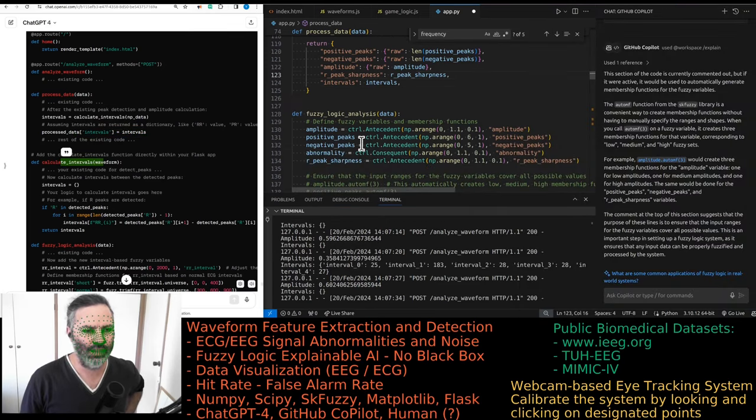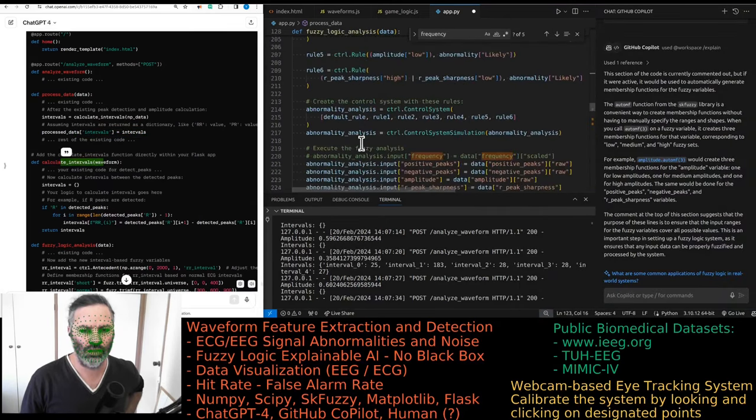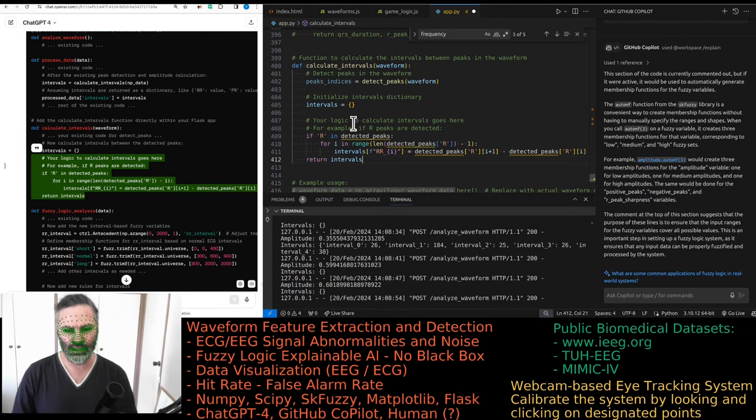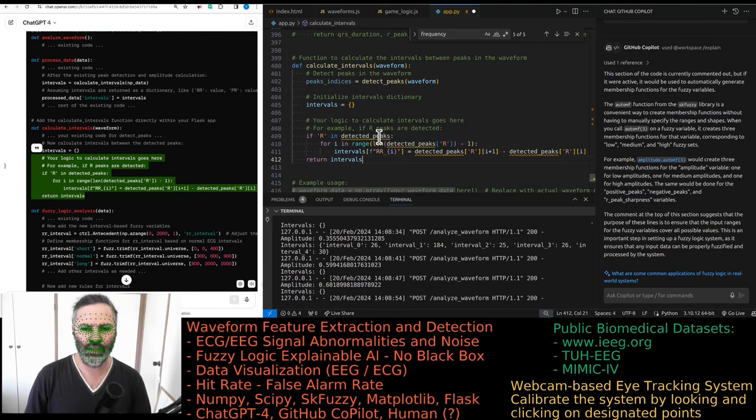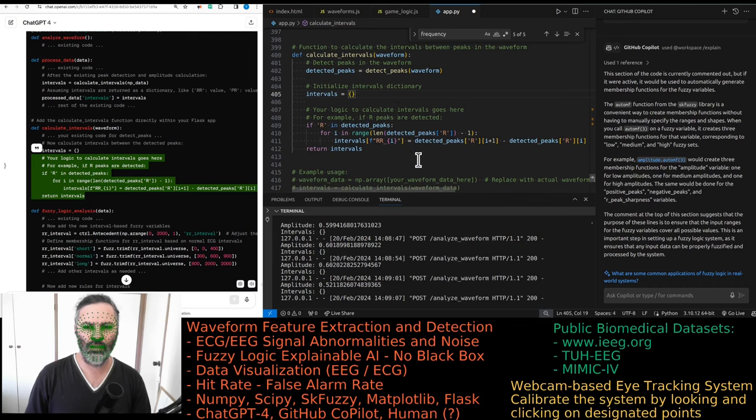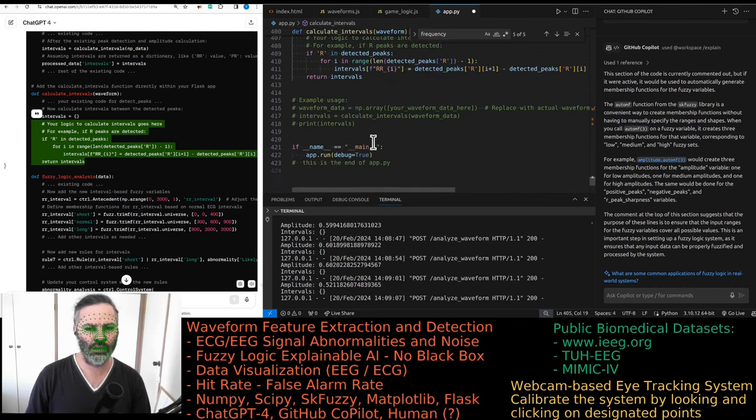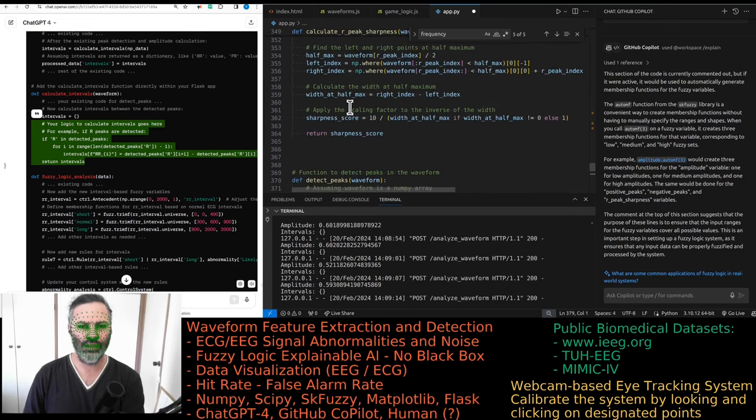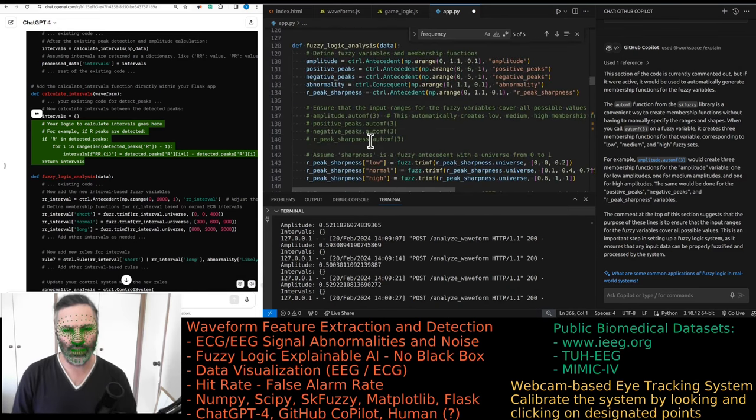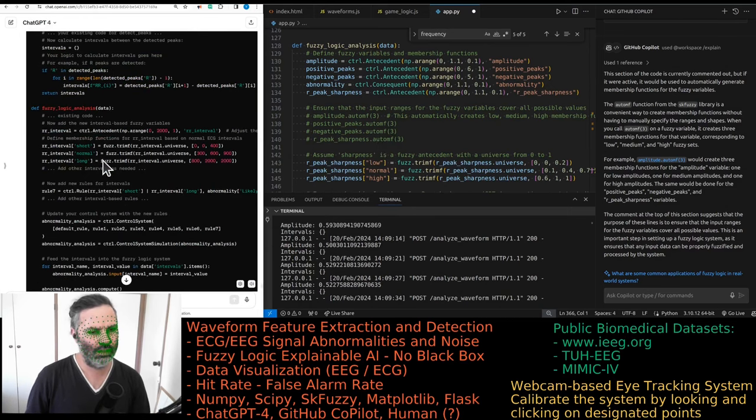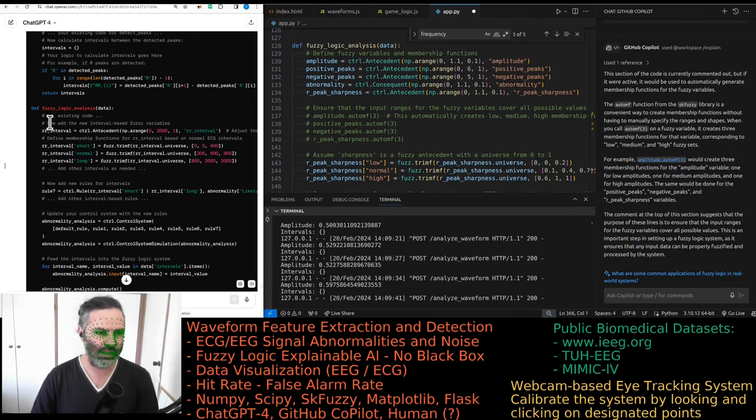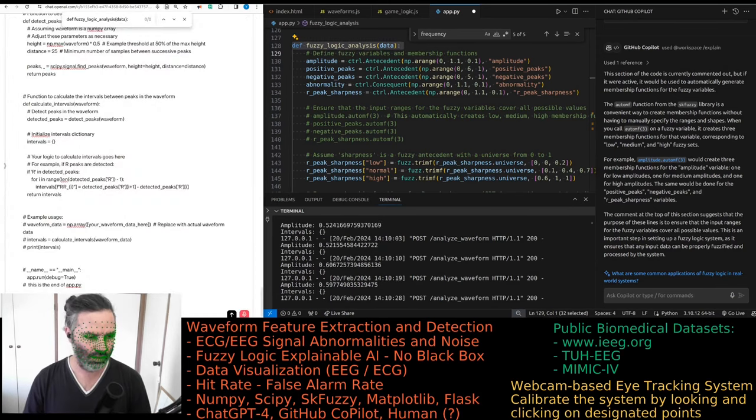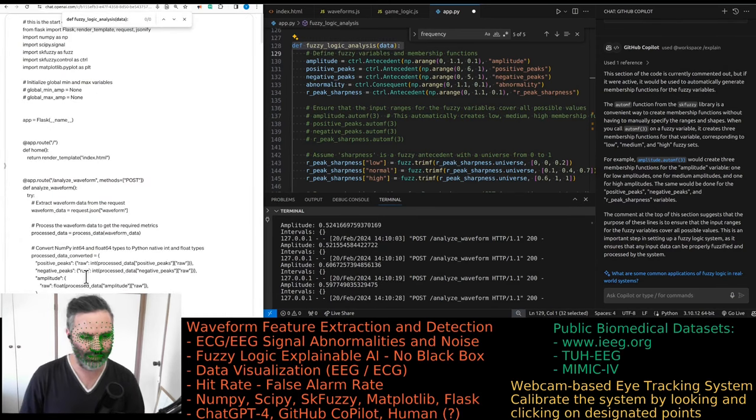We have the calculate intervals function. Is it giving a different function every time? This is better. This is covering a case where there is no R peak, for example. Now we need to modify. Get rid of that. And fuzzy logic analysis, that's the tricky business.